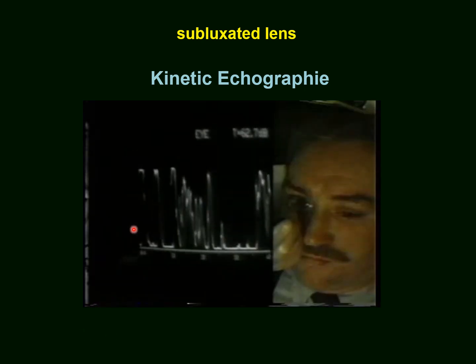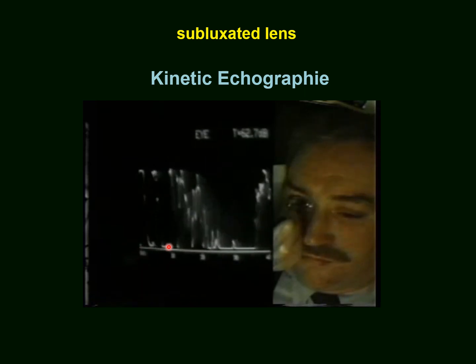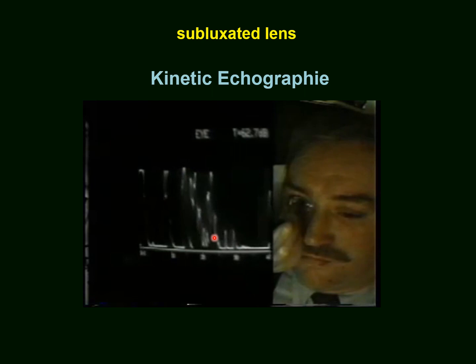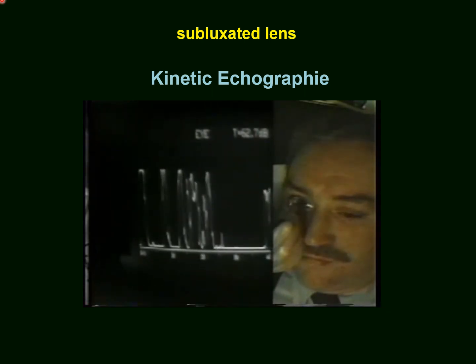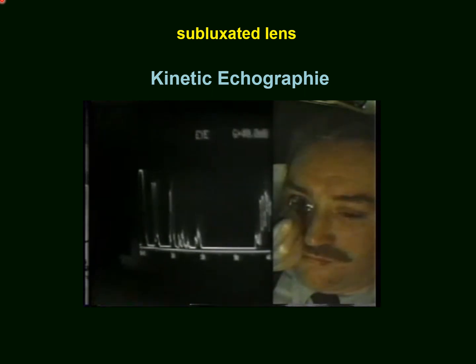The A-scan here: fluid, cornea, anterior chamber, iris, lens. When the distance of the probe is changed, the reverberation signals move twice as fast. And then watch the iris, the trembling after movements of the iris, not caused by an eye movement, but in the fixated direction of the gaze.